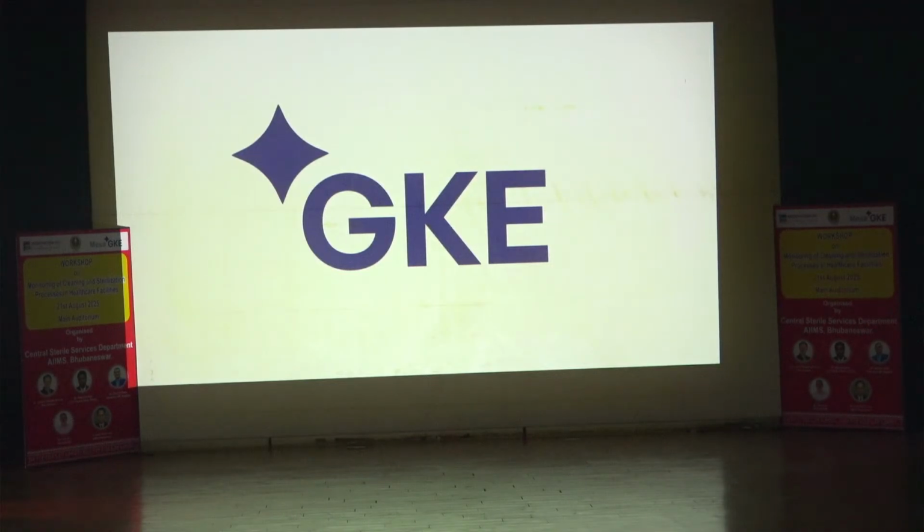So you remember in the presentations that we had already that steam sterilization requires something, and this was being mentioned many times, for example in the presentation video in the beginning when we all arrived, and here was a very nice presentation about this hospital, that steam penetration is crucial when it comes to steam sterilization. The steam has to go everywhere in order to ensure that sterilization is successful. And I want to show you in a few slides why this is the case.